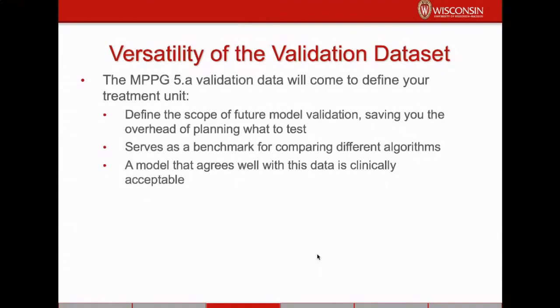A nice thing too is that it serves as a benchmark for comparing different dose calculation algorithms, whether they're new algorithms in the same treatment planning system or different treatment planning systems. And a nice thing too is that, by definition, MPPG 5A defines what a clinically acceptable dose calculation model is.